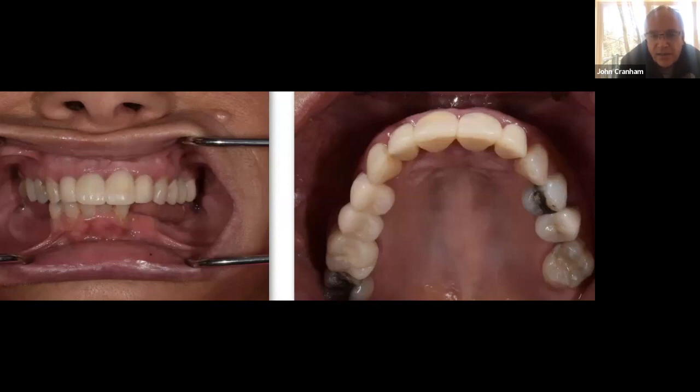And then the other thing to think about, and Kim Daxon's made this point, is if you do chop all that bone off and the implants don't integrate, then what the heck's the patient going to do? Yep. Now they don't have anything. So I think that's a really good point. I just wanted to chime in.